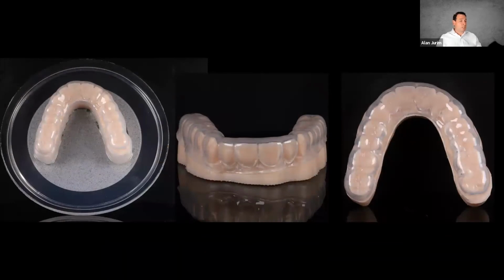We can make sports guards. We can make mouth guards. We can also make different Essex appliances for patients' provisionals. And this is really a time saver and a money saver, because we could eliminate having to physically transport work in the mail, right?